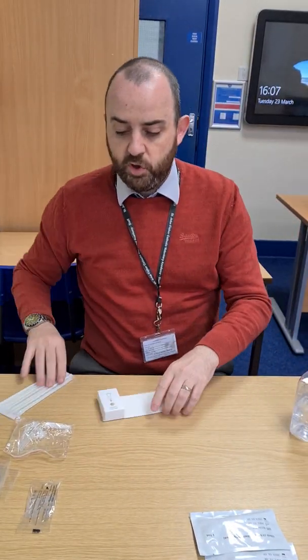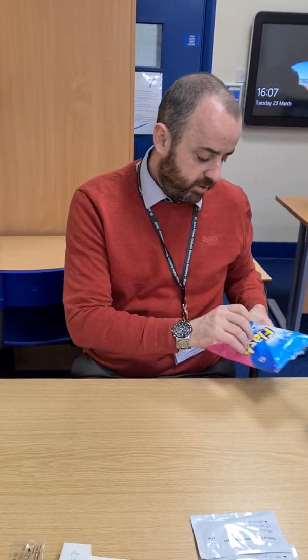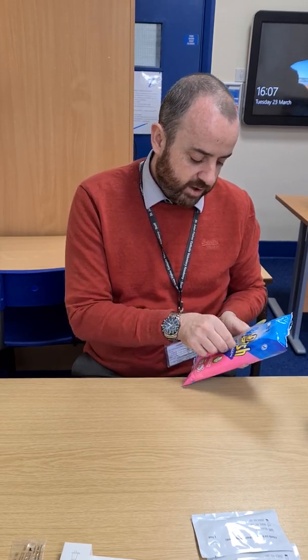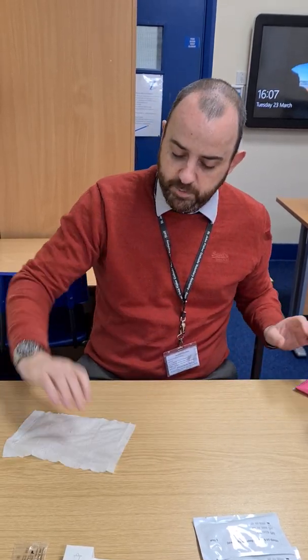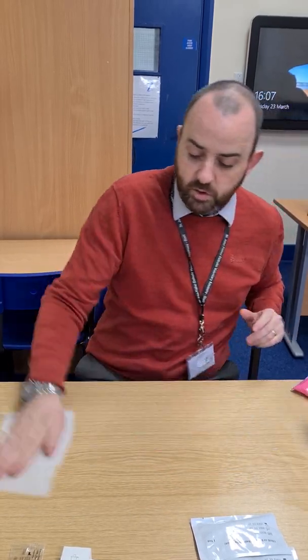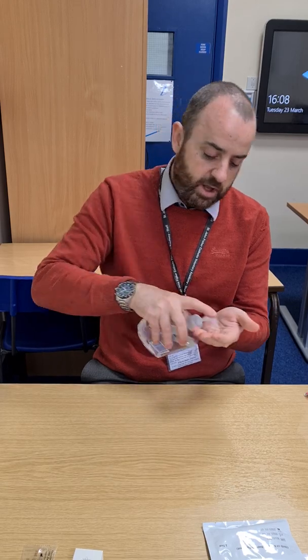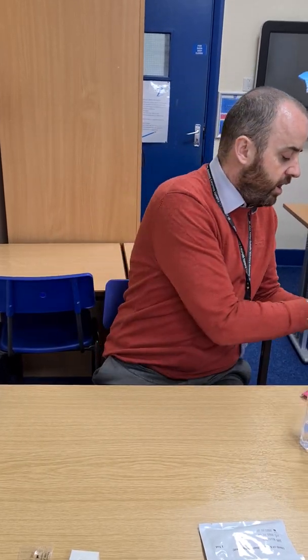The first thing to do is prepare the area where you're going to complete your lateral flow test. Get a clear desktop or table and using some spray or an antibacterial wipe, give the area a wipe down so nothing will cross-contaminate the test. You then need to either wash your hands thoroughly for 20 to 30 seconds, or use antibacterial hand cleaner.